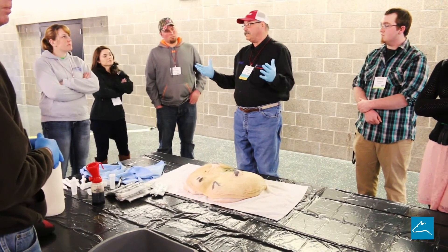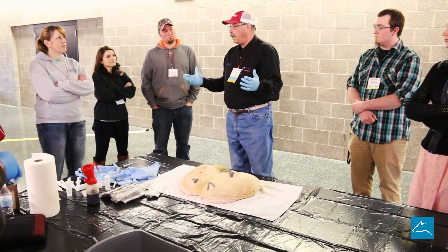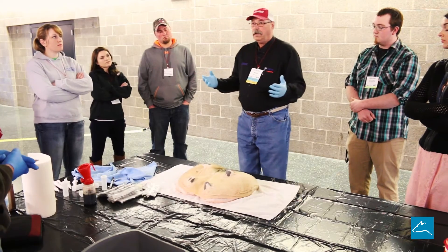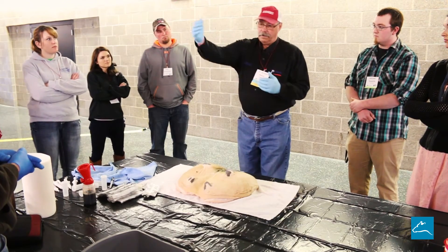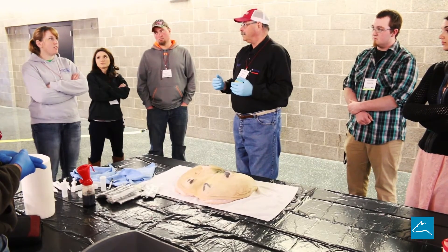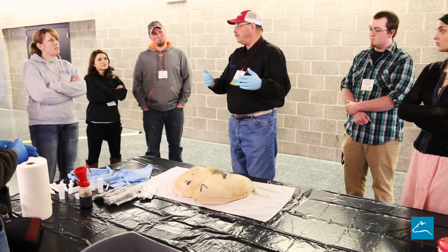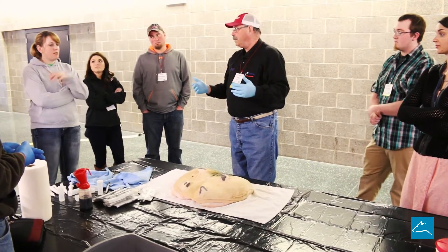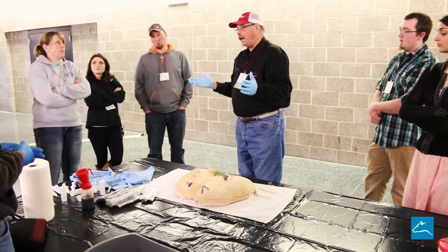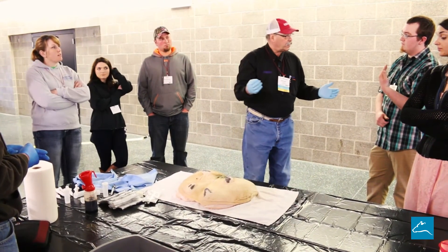If you're doing an individual sample that you've CMT'd and you know which one is running the higher cell count, fine. If you're doing a composite sample, it's near far, near far. Also, some people culture all four quarters in the same vial. If you don't want to mess around with the CMT and want to find out — we culture once we see visible chunks. That's how we do it, though some people do it differently.